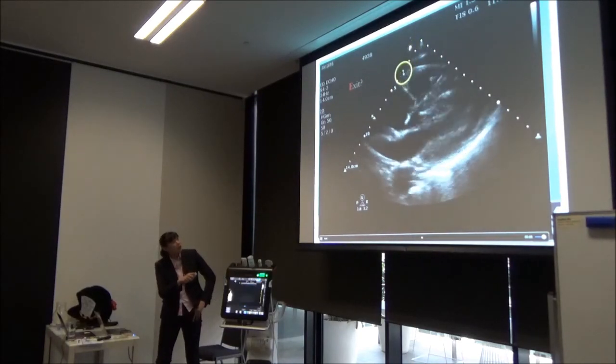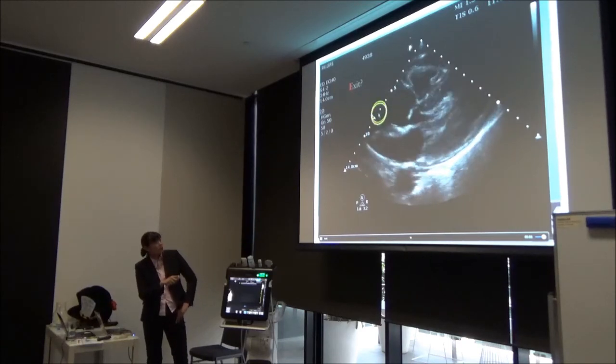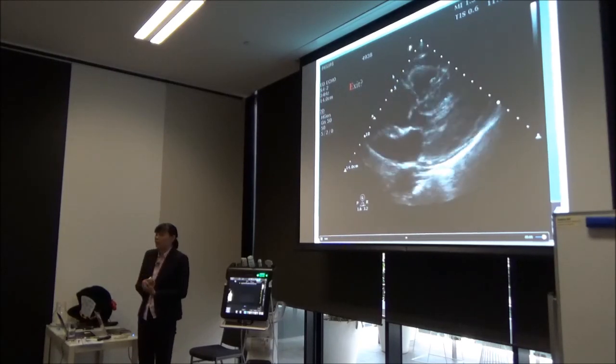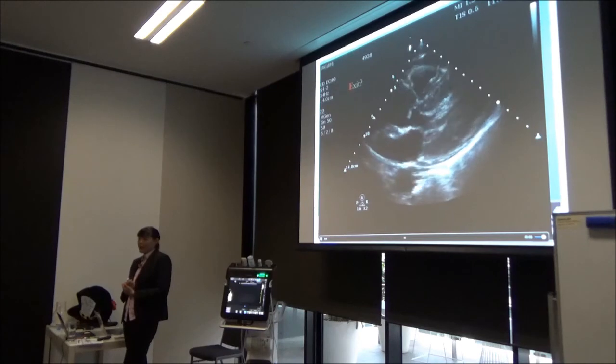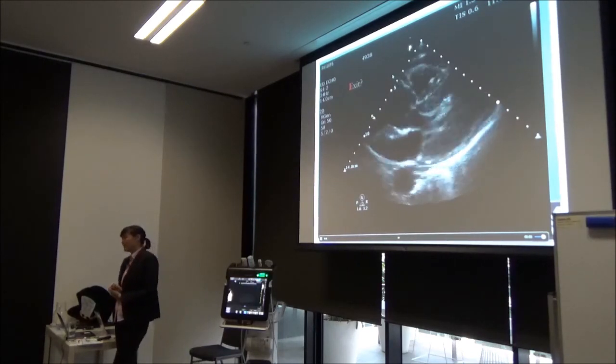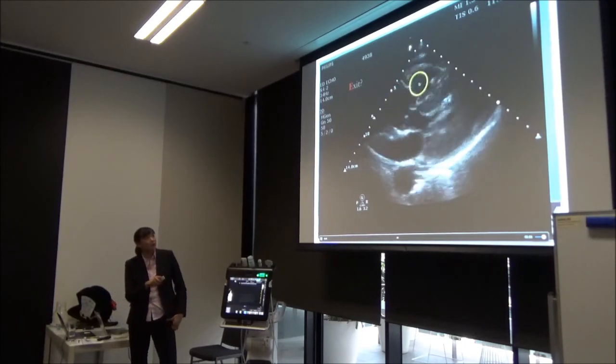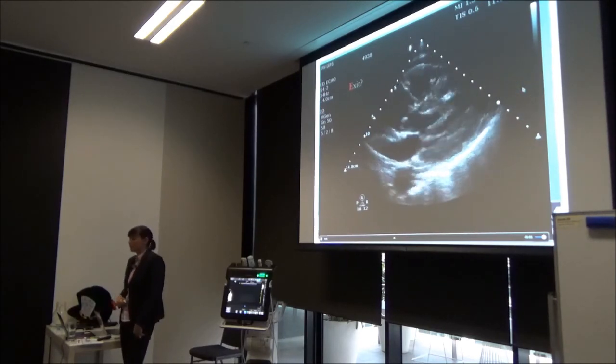So I know this is my off-axis view, but here's the thoracic aorta. Let's see. We measure from the outside wall of one part of the wall to the inside. That's by convention how you measure a thoracic aorta. So I'm going 1, 2, 3, 4, just about 5. Normal is 4 centimeters. Completely abnormal is over 4.5 centimeters. So what probably happened was you have a thoracic aneurysm or thoracic dissection that has ruptured near the root, causing the pericardial effusion that was tamponade.